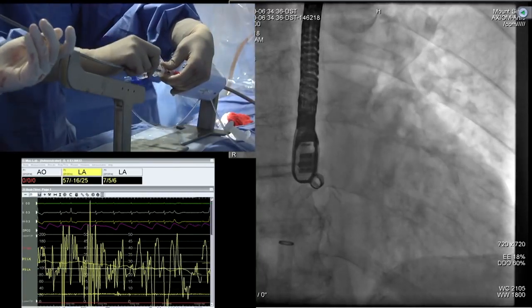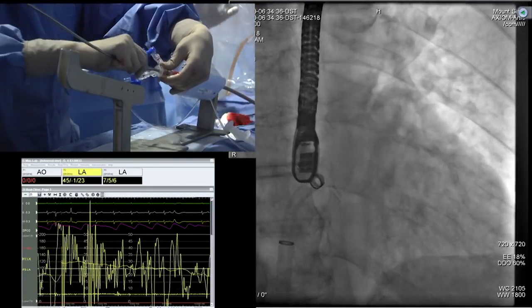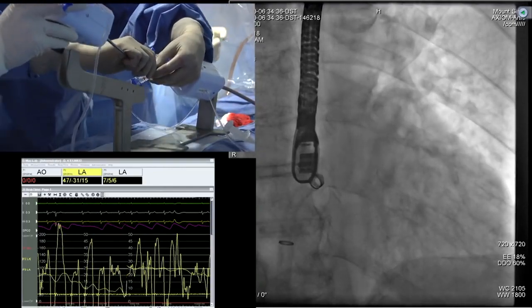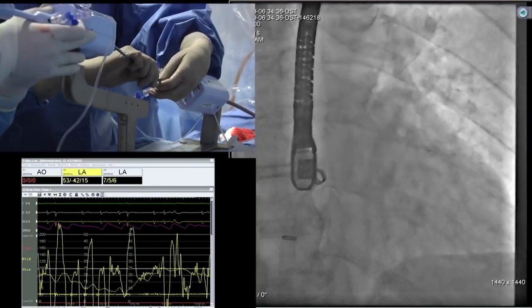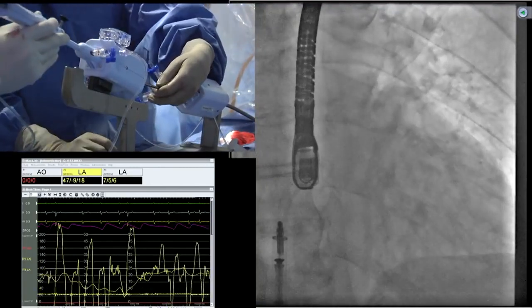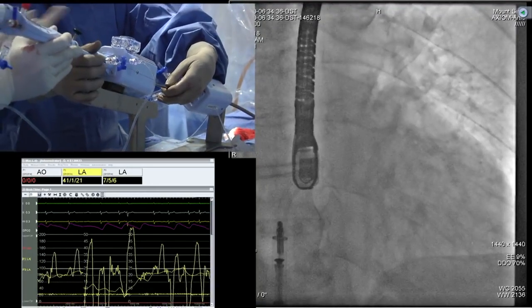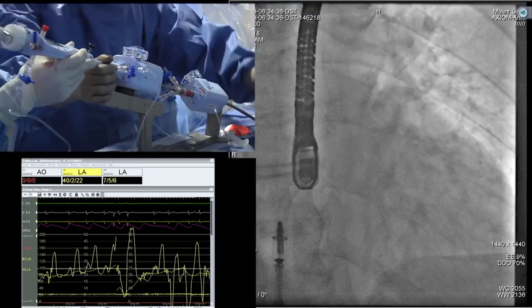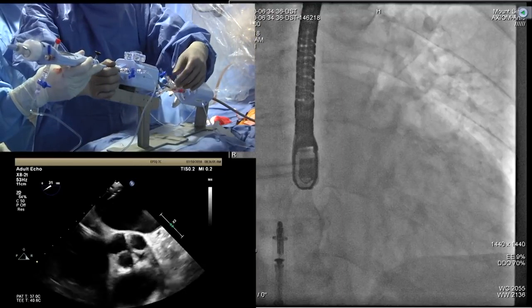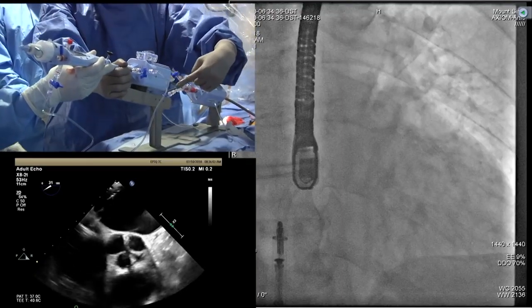What we've done also, you can see on fluoro, we cine the guide position where we think that we are in safely and have enough across. So we have used that as a reference point. We can also use fluoro at the same time if echo is not able to get the image to see how much guide we have in place. Can you focus this side?